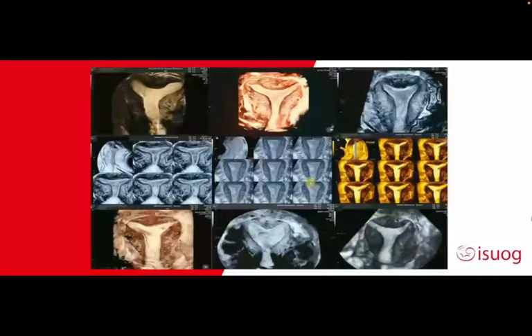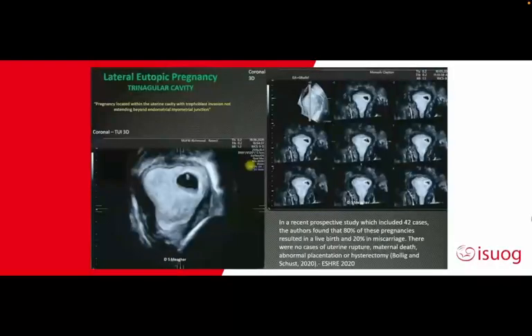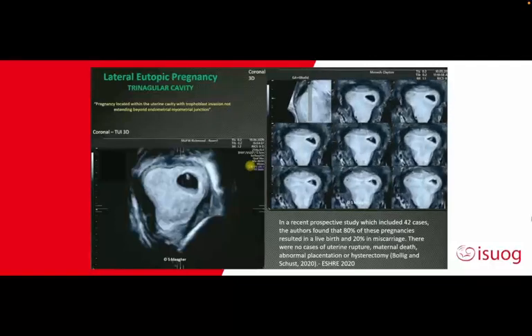And it's very important to go through a systematic approach, looking at the patient's symptoms of pain and bleeding, examination findings of tenderness, and scan findings of free blood within the pelvis, and laboratory findings of slowly rising beta HCG patterns. So it's a combination of all those four: the history, physical examination, scan findings, and laboratory testing will help you distinguish between the two. I would like to take you through some examples because some can be quite challenging.